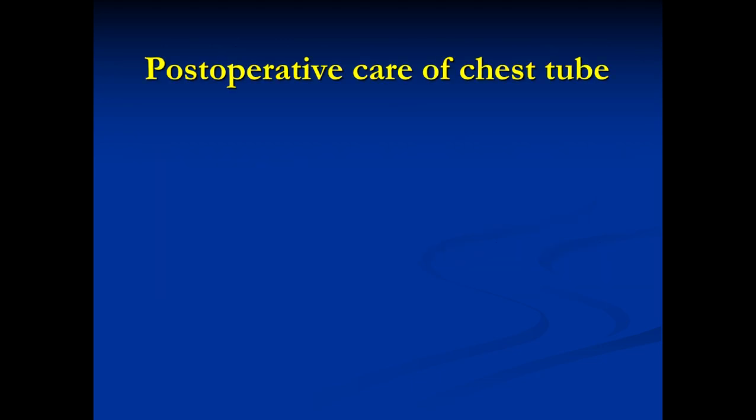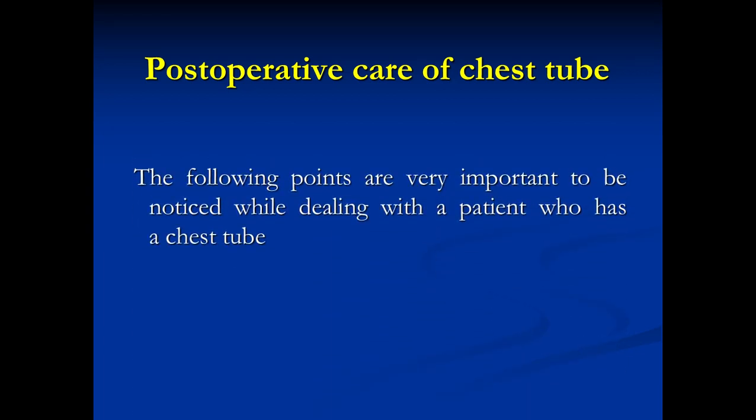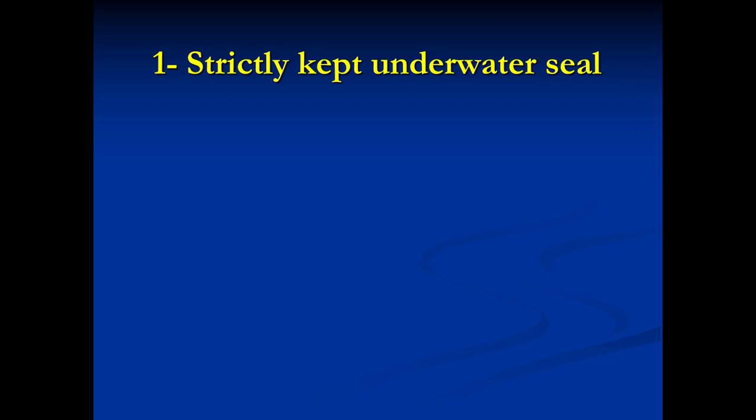Postoperative care of the chest tube. Number 1: strictly keep underwater seal. That is a very important item.